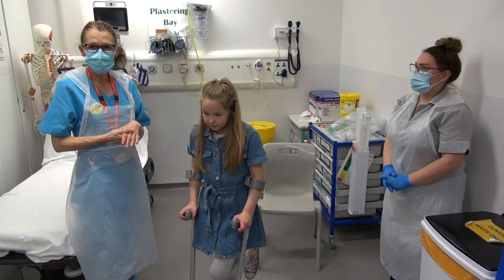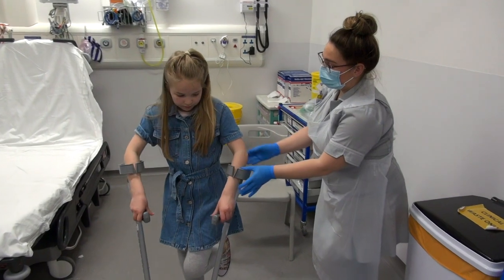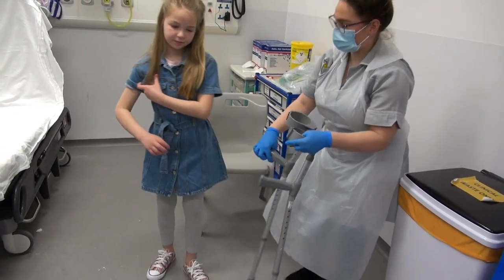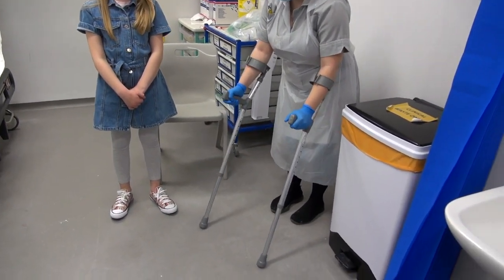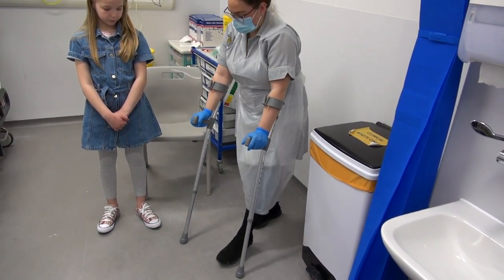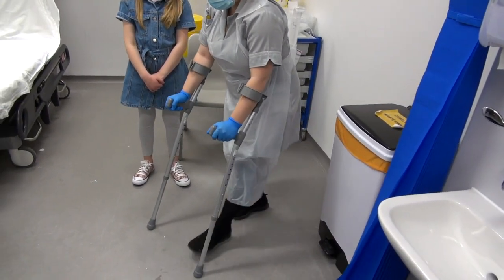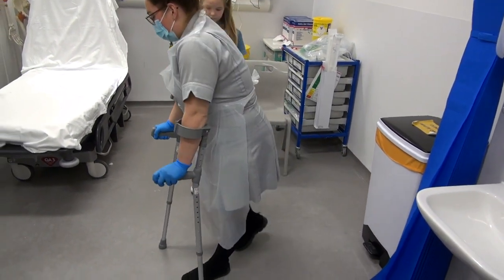We can show you how to do partial weight-bearing now. I'll just demonstrate and then let you have a go. Exactly the same — crutches forward. And then with your bad leg, pop that forward into the level of the crutches. And then bring it together with your good leg. So: crutches, bad leg, good leg. Crutches, bad leg, good leg.